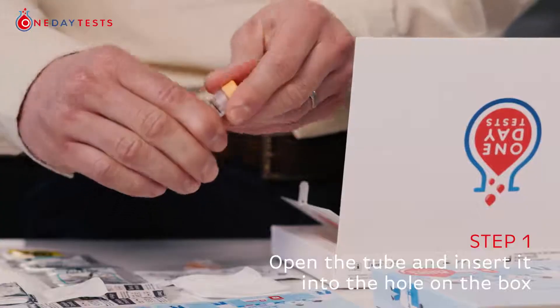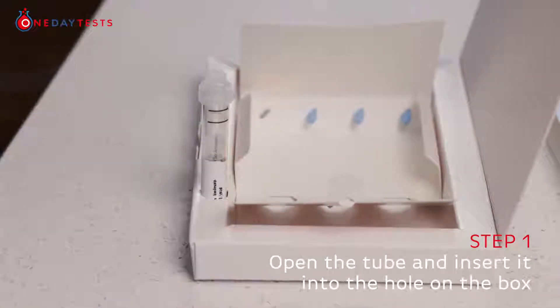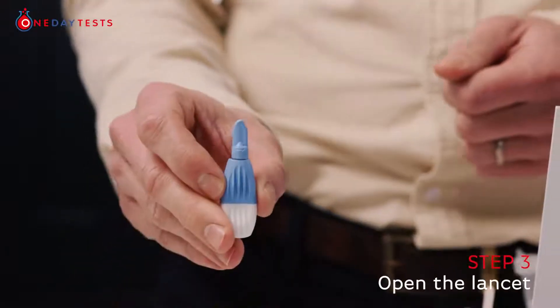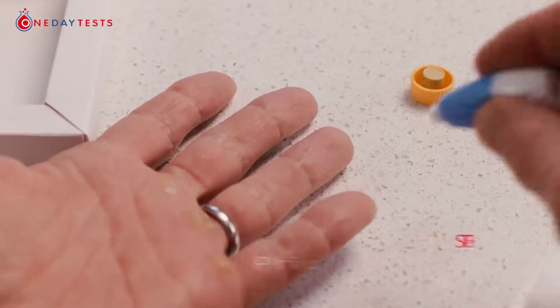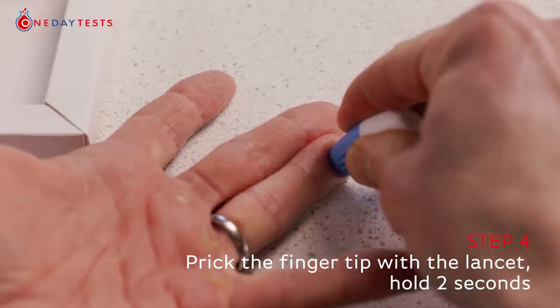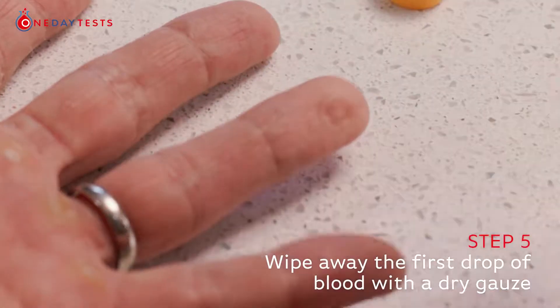Take the coloured cap off the tube and insert the tube into the cutout hole on the box. Wipe your ring finger on your non-dominant hand with the alcohol swab and let it dry completely. Twist and remove the cap from the lancet. Press the lancet firmly down on the side of your fingertip until it clicks and hold for two seconds. Wipe away the first drop of blood with a dry gauze pad.